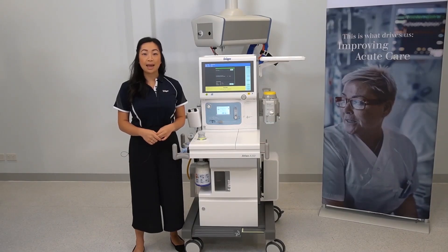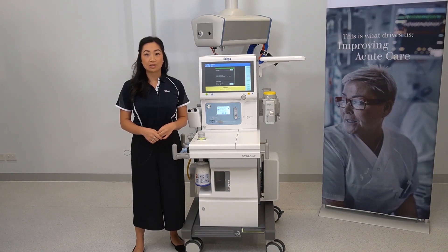Hello, my name is Samantha and in this video I'll be orientating the user to the ATLAN A350.